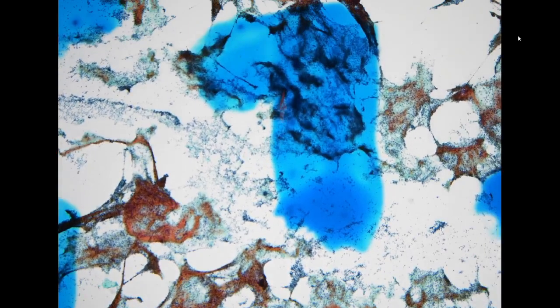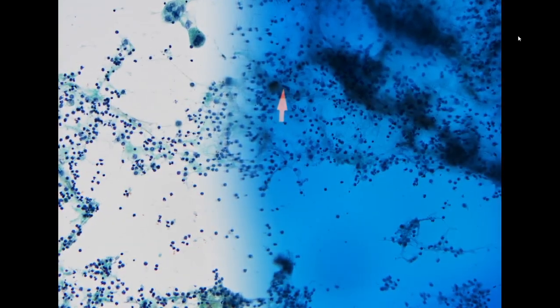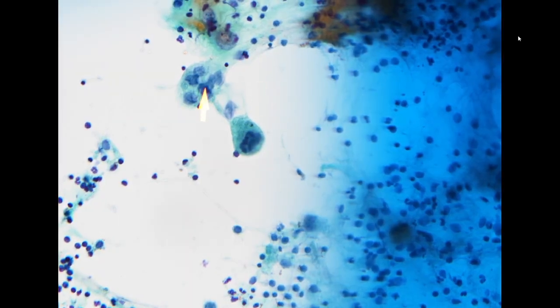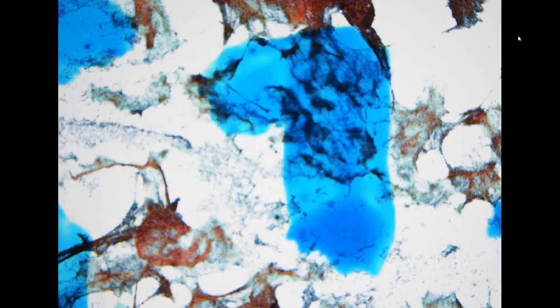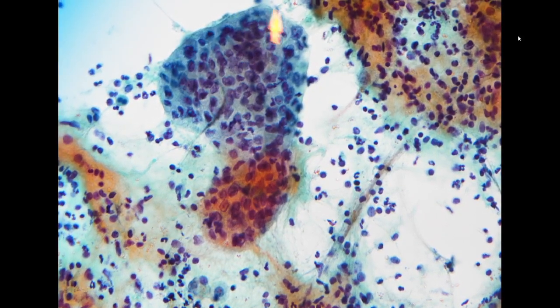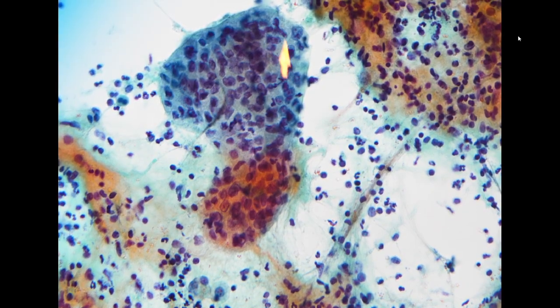So this is very typical cytomorphology of a pancreatobiliary origin adenocarcinoma. We have a couple of these clusters. Because the primary is in the pancreas, it has already crossed the diaphragm to the pleural cavity. But this is also a very obvious cluster of metastatic cells. So this is positive for adenocarcinoma and also compatible with a pancreatobiliary tract origin.